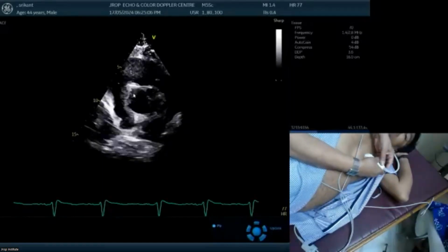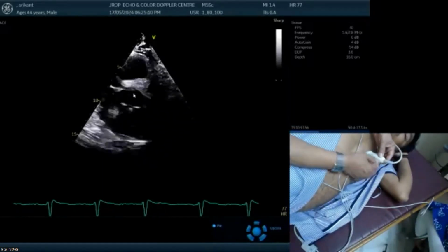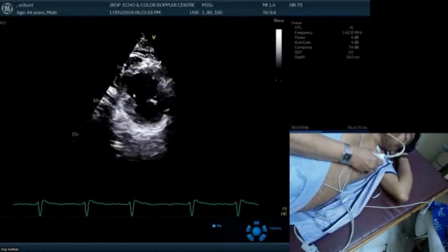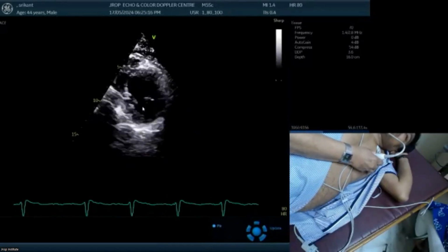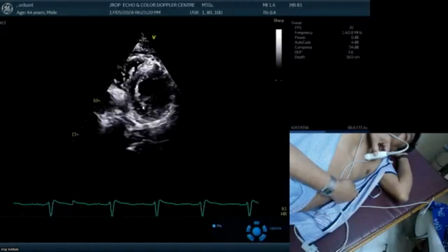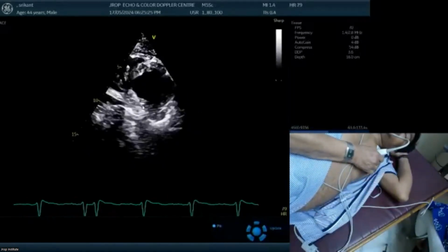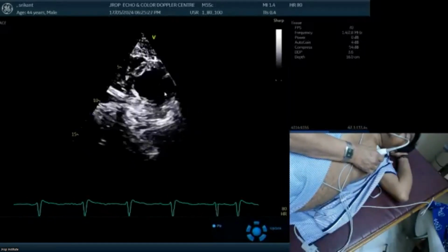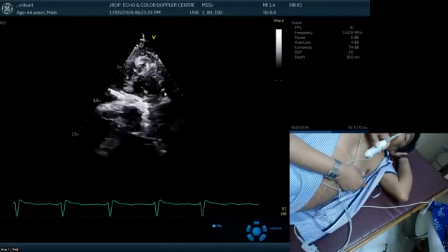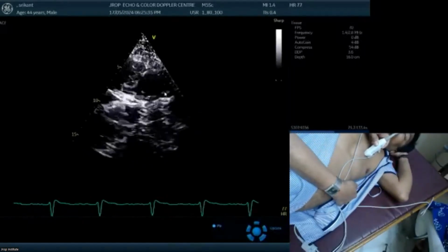Now look at the footprint. It's looking towards aorta. Now I'm going almost 90 degrees right over there. So it starts in the mitral valve. So here's the mitral valve. If I go towards his left hip, I'll go to the first papillary muscle level. Now you can see the papillary muscles, both papillary muscles, one over here, second over here. And third, we go to the apex, and this is what the apical segment is when the footprint is looking towards his left hip.